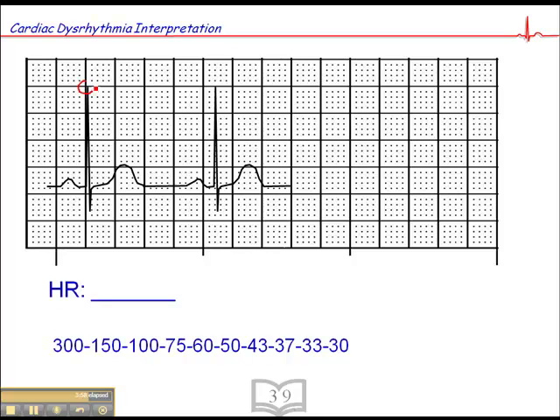Here we have a QRS that falls pretty close to a dark line: 300, 150, 100, 75, 60. So the heart rate is between 75 and 60. 75 minus 60 is 15, divided by five small squares is 3 beats per small square. So the heart rate is 63, 66, 69.